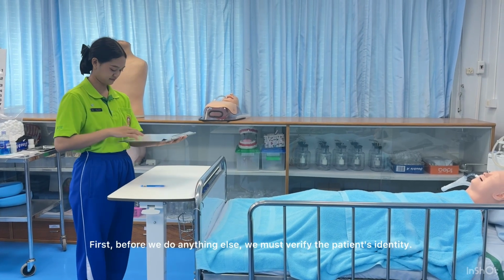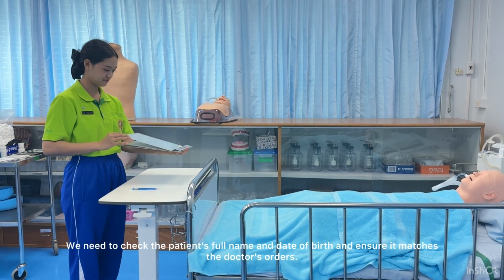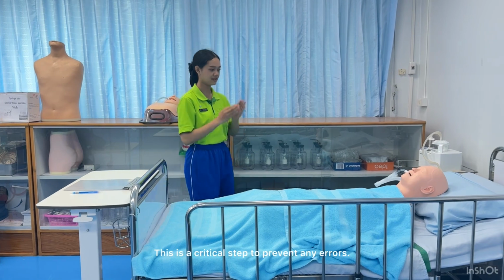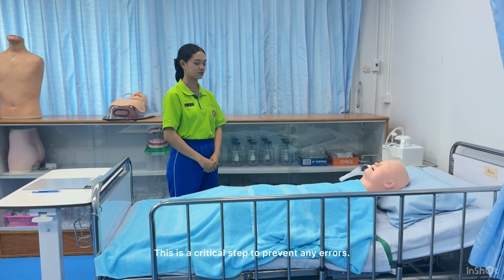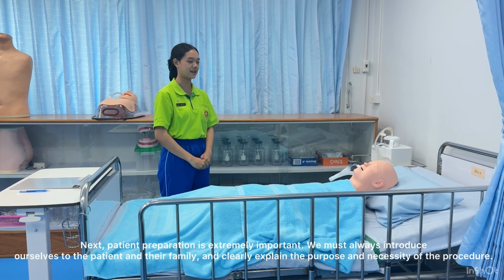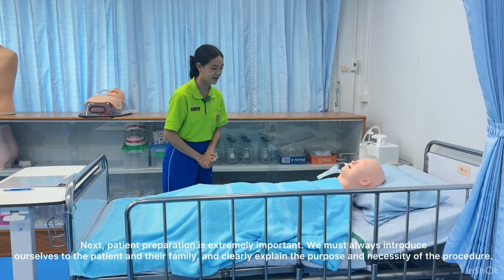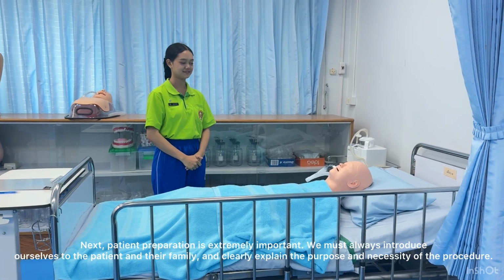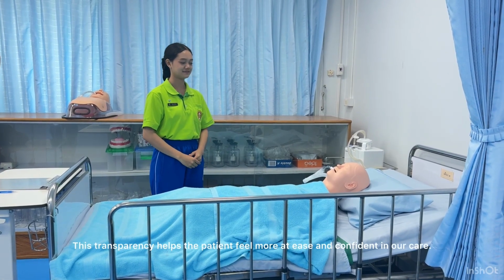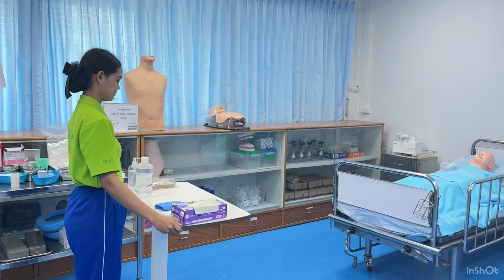First, before we do anything else, we must verify the patient's identity. We need to check the patient's full name and date of birth and ensure it matches the doctor's orders. This is a critical step to prevent any errors. Next, patient preparation is extremely important. We must always introduce ourselves to the patient and their family, and clearly explain the purpose and necessity of the procedure. This transparency helps the patient feel more at ease and confident in our care.